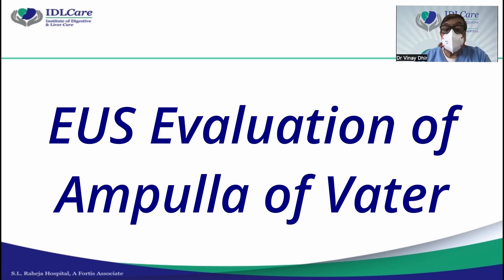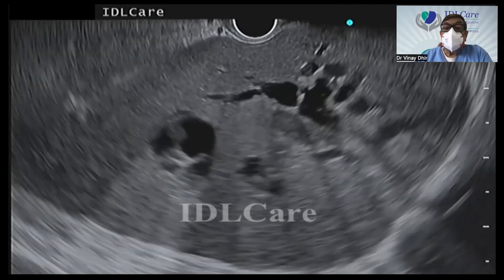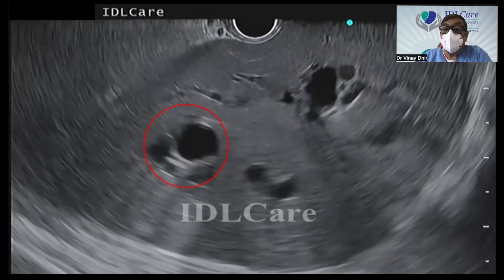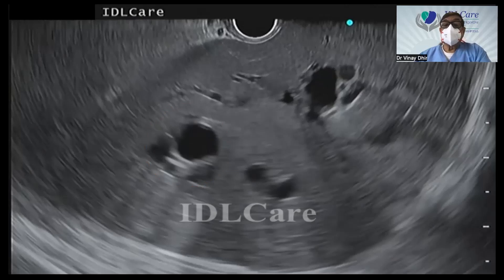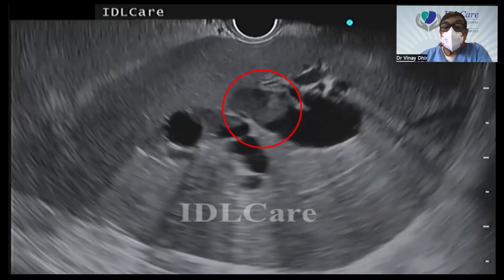I normally start from the liver always, to look if there is dilatation of intrahepatic biliary radicals. As you can see here, you have hugely dilated biliary radicals. You should be able to identify segment 2 radicals and segment 3 radicals, in case you decide to do ultrasound-guided biliary drainage. Once we have identified this, we see here there is probably sludge or pus.